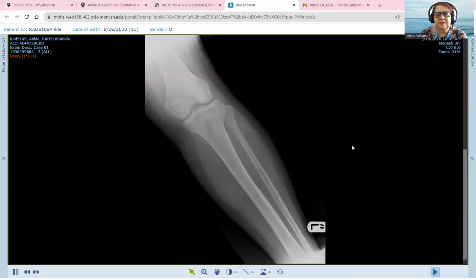Good day. With this presentation, I'm going to give you feedback on the ankle and lower leg practice cases that I've given you. I hope that you've completed the opinion form, so have that at hand and then self-mark as you go along.